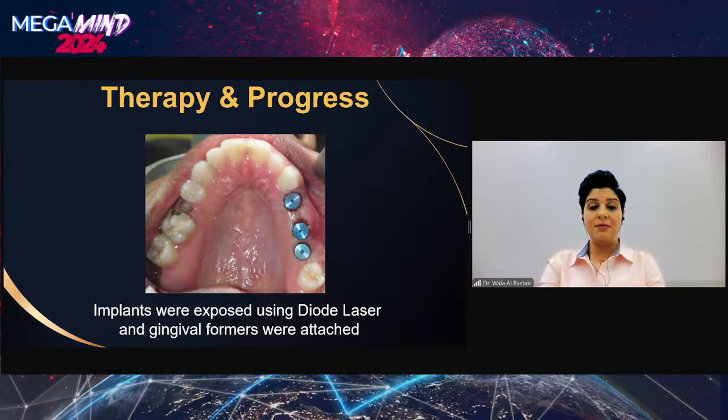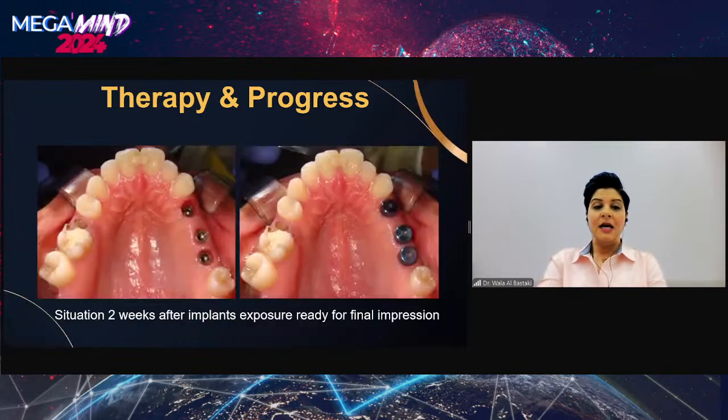So the implants were exposed using diode laser and the gingival formers were attached. This is the situation 2 weeks after implant exposure, ready for the final impression. I love the gums, to be honest, the pink aesthetics.